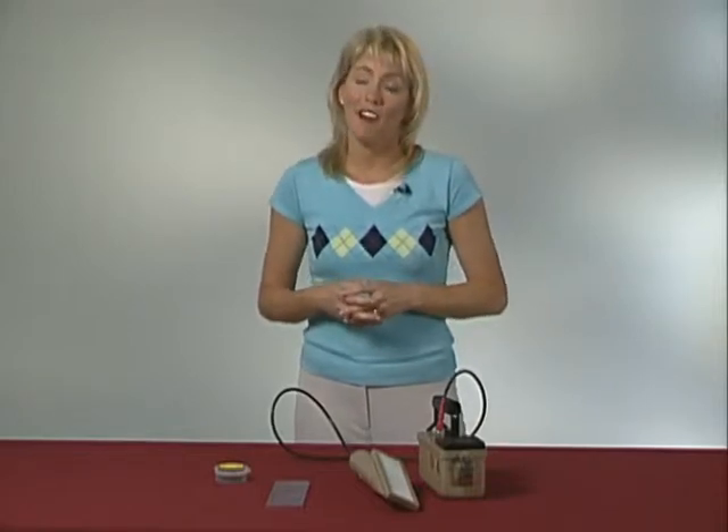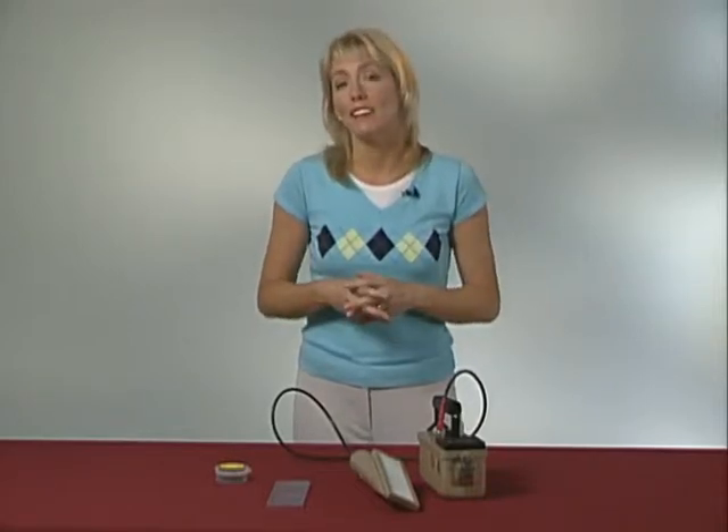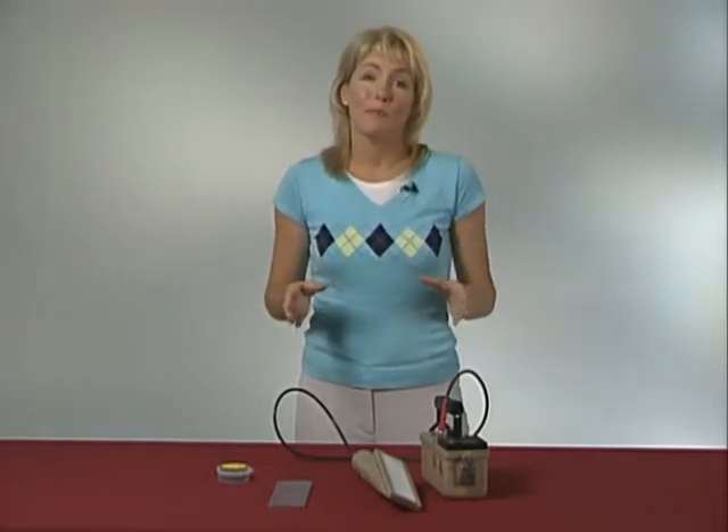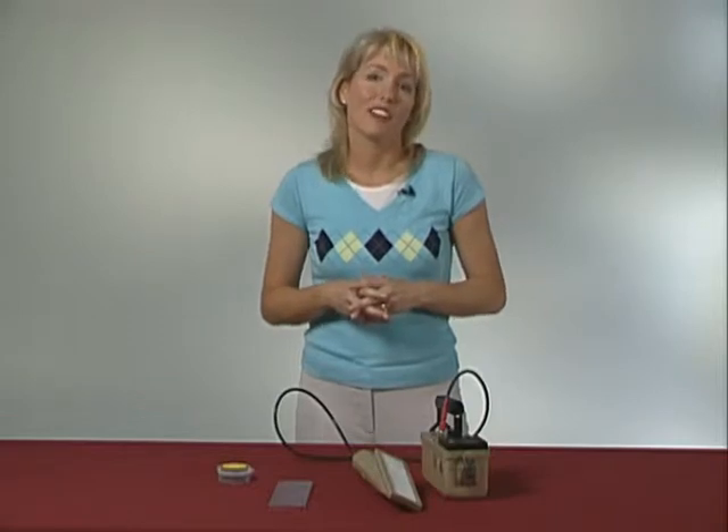Fortunately, once you know where they are, the holes are easy to repair. All it takes is a tiny dab of black paint, so don't forget to have a bottle on hand — the sort you can get at any store that sells hobby supplies. Black nail polish is an even better choice because the bottle will come with an applicator.